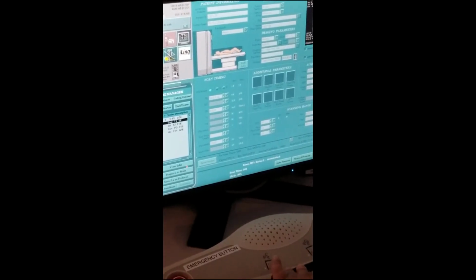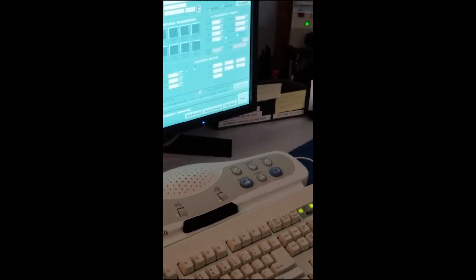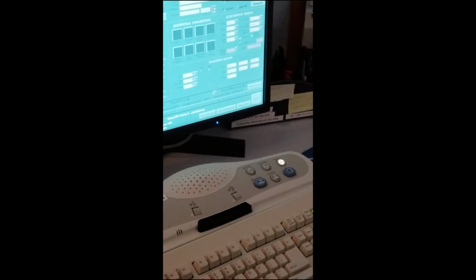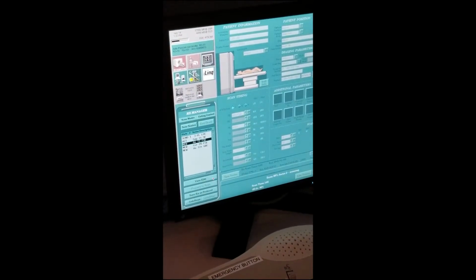If it's 400, then that's too low, because on this machine. On a 3T, maybe 350 is okay. You understand? Because the lower the TR, the more noise introduced into the system, so the image quality would suffer.